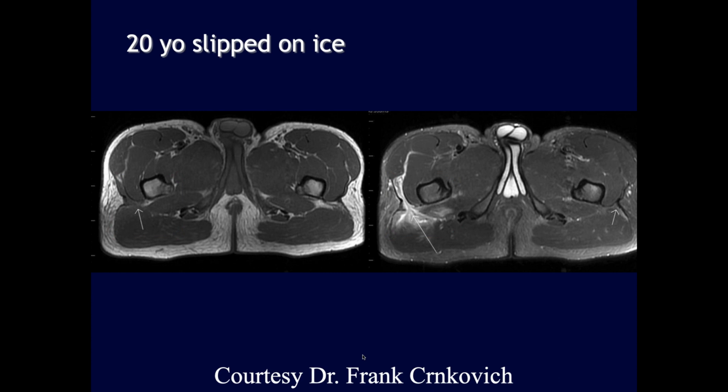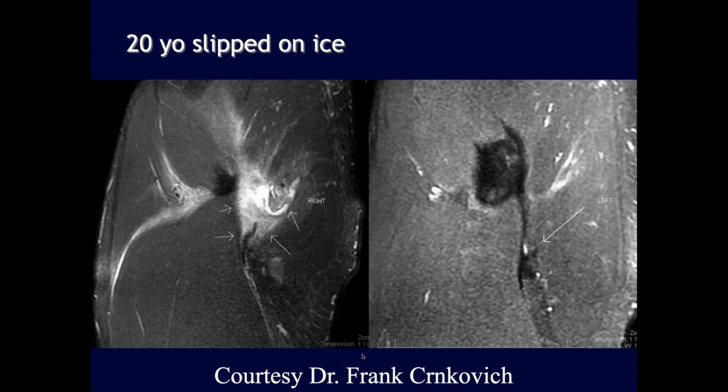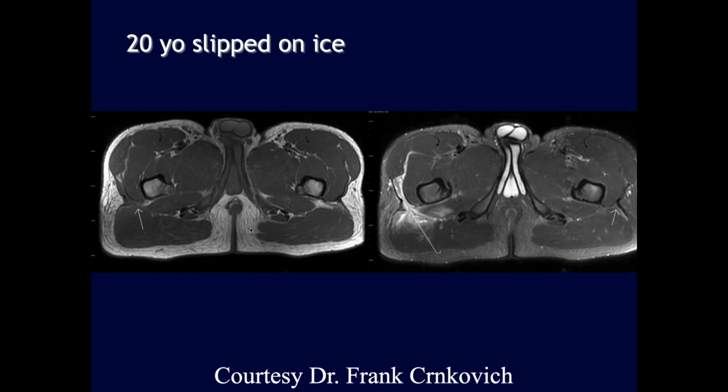The 20-year-old that slipped on the ice. It looks like there's increased signal and hemorrhage along the anterior aspect of the gluteus maximus. And here we can see what looks like an intramuscular hematoma within the gluteus maximus, and there's some partial thickness tearing of the musculotendinous junction.